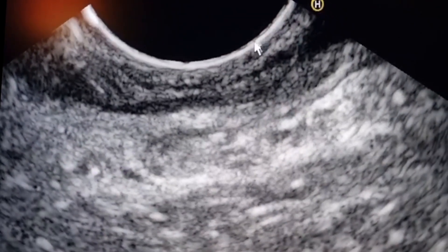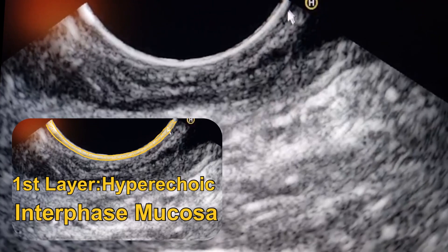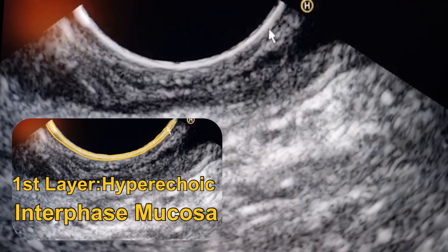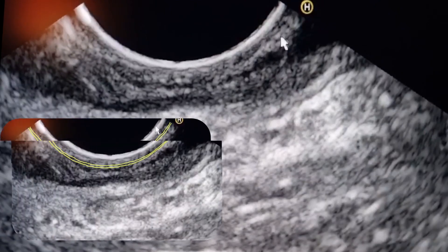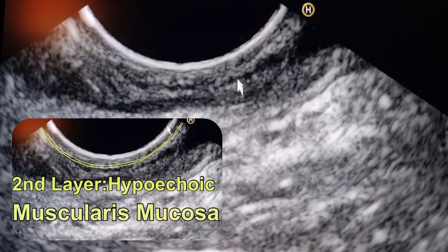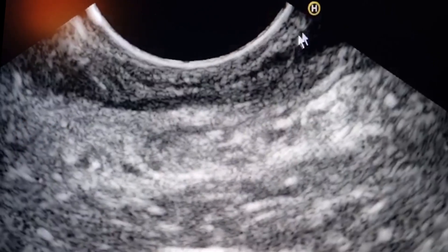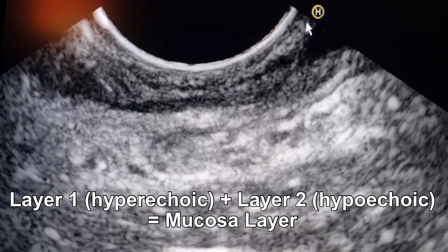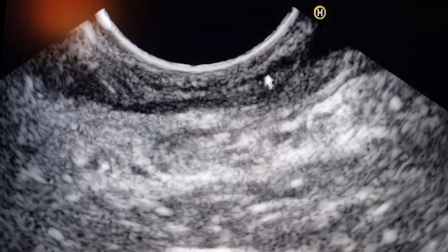This is the interface between the mucosa and the endoscope, and this is the muscularis mucosa — the second layer. This is the submucosa. This is the submucosa and these three layers: the muscularis mucosa, the submucosa — the third layer — and this is the muscularis propria. Three layers.